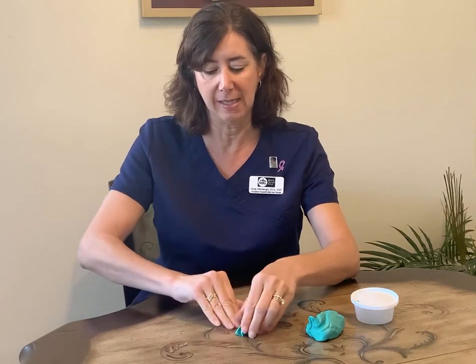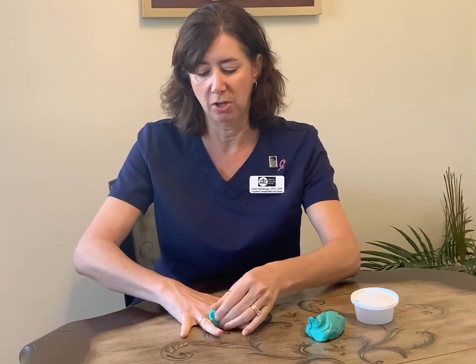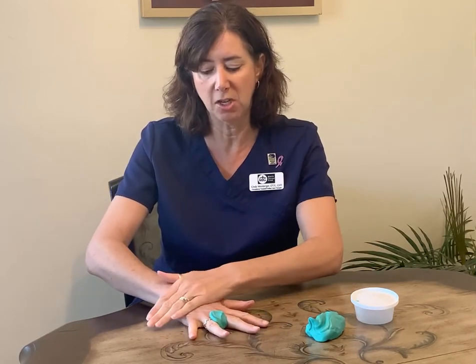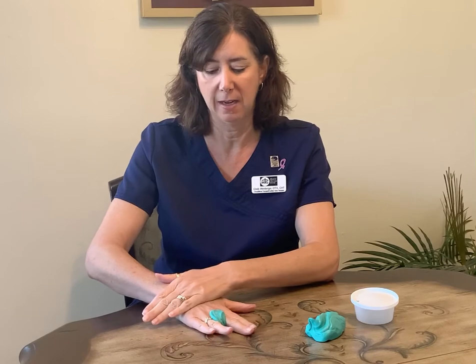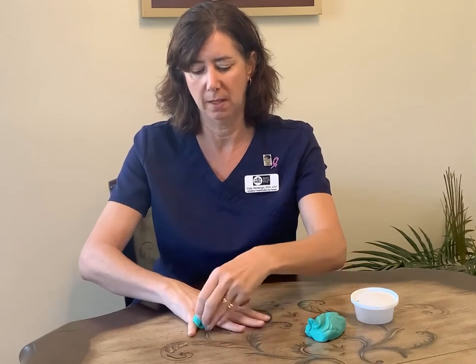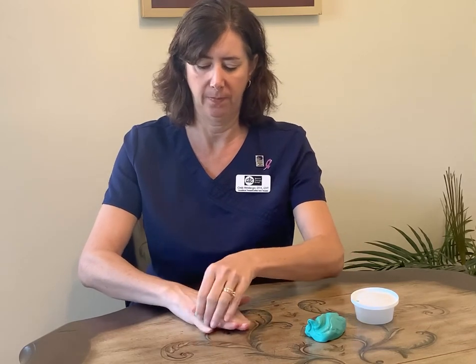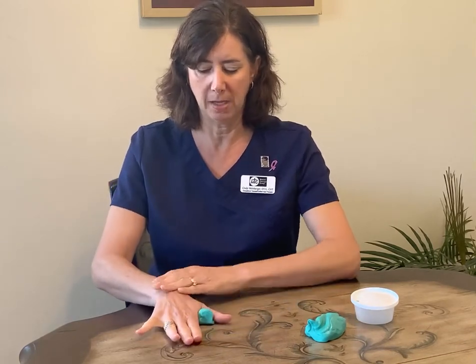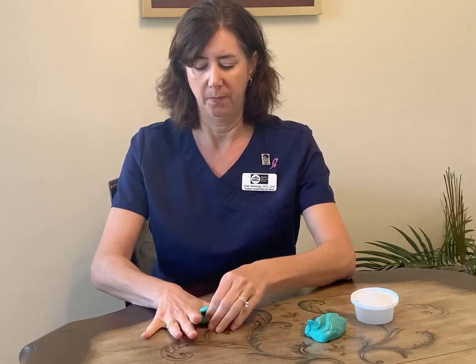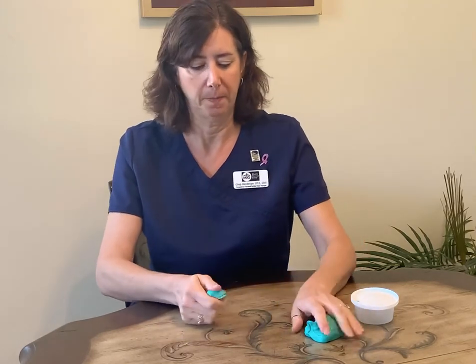Your tendency is to let it pop up to recruit stronger muscles. But in order to strengthen the intrinsic muscles in your hand, you want to keep it flat and bring your fingers together. And the pinky. Okay. You can do the thumb as well. This exercise, though, is mostly focusing on these muscles in between the fingers.